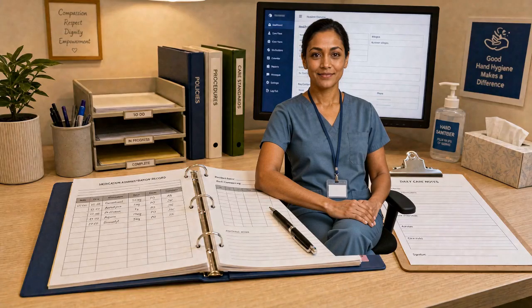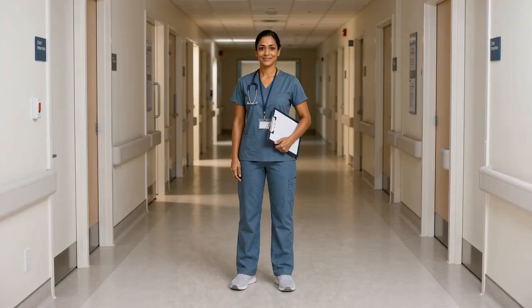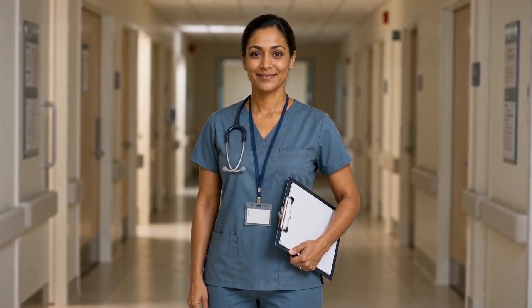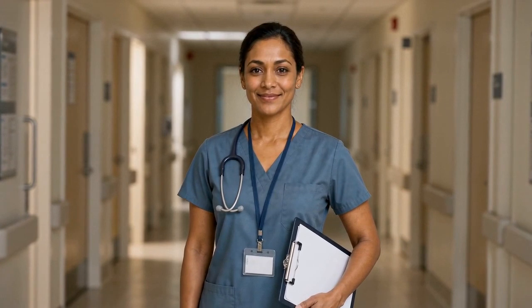Check carefully. Consider whether the resident is eating as expected. Follow the authorized orders. Document what actually occurred. And when the resident's condition or circumstances do not match the plan, follow your program's escalation procedures and obtain appropriate clinical guidance. Monitor. Consider the meal. Follow the order. Document. Communicate.